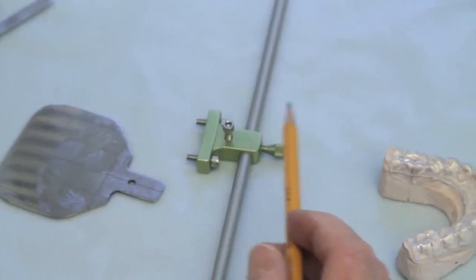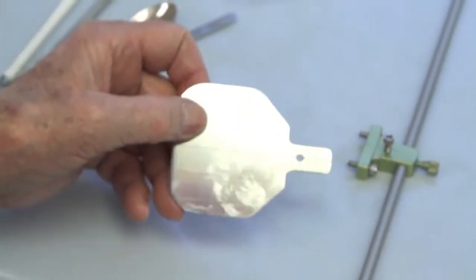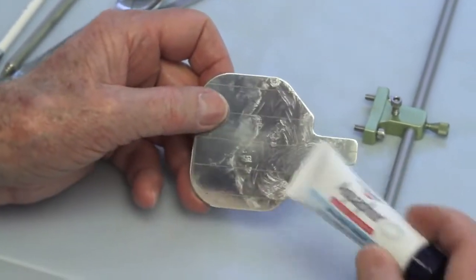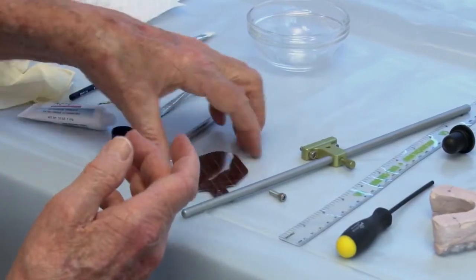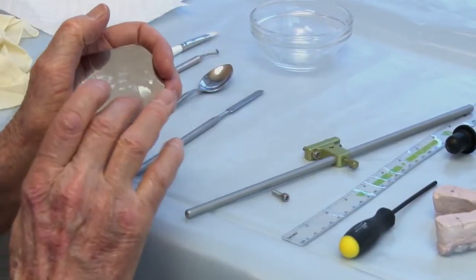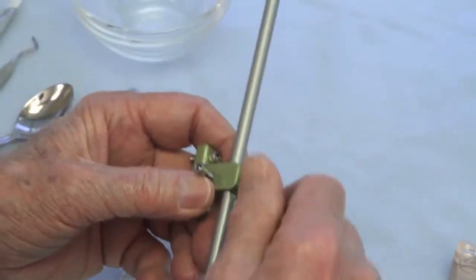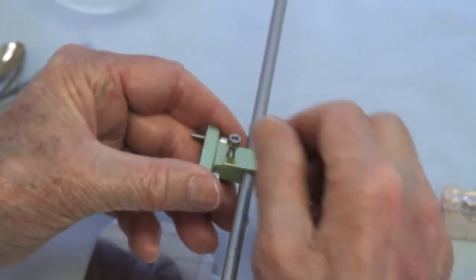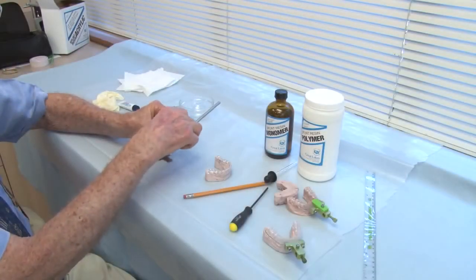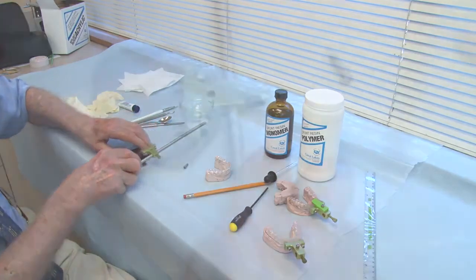And to do that, the first thing I want to do is take the plate that is used and put some thin coating of Aquaphor in the area where I'm going to use quick cure acrylic. And I like to use the crossbar at the same time because it helps me kind of judge symmetry. So I put the crossbar in place. This screw will actually go on the bottom to hold the plate. So you want to hold the plate in place like this. And so I have to turn this over and attach the plate.